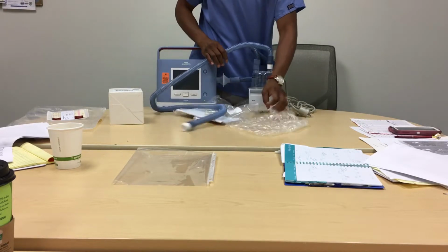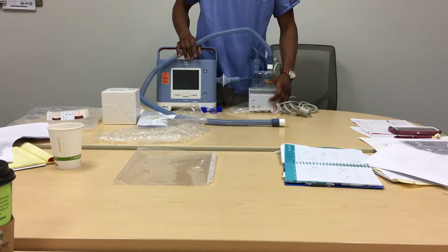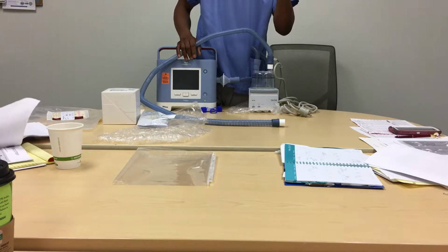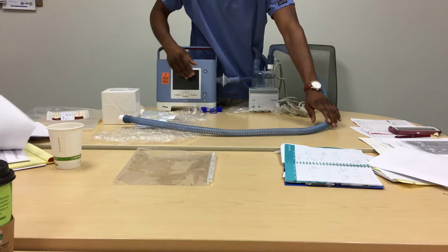Now, depending on the kind of heated base they are using, with these, they don't do a fixed temperature. It's always a range. You get some, like the HC550s, that you can dial in a set temperature. Your interface connects here, and you're good to go.